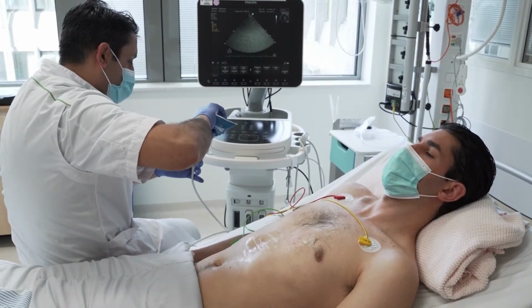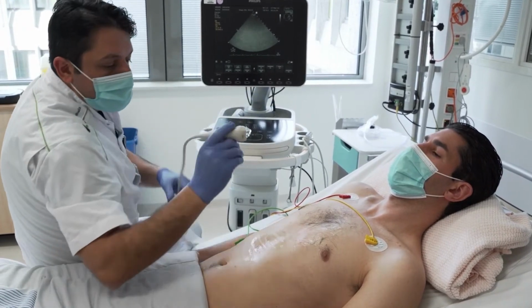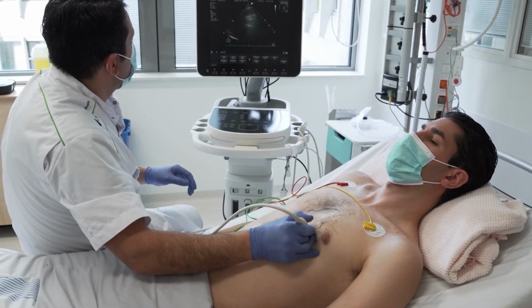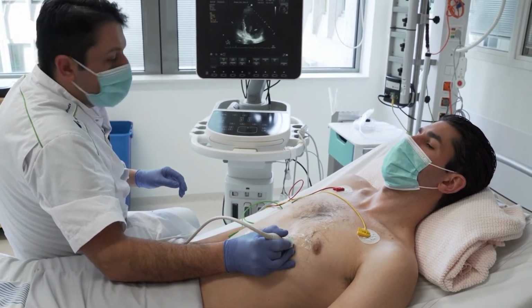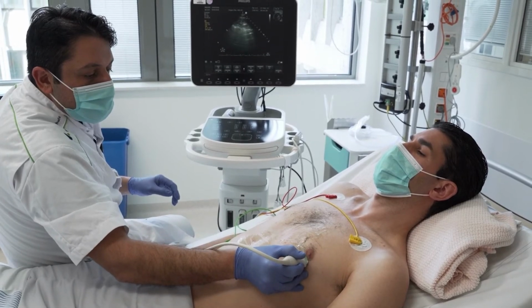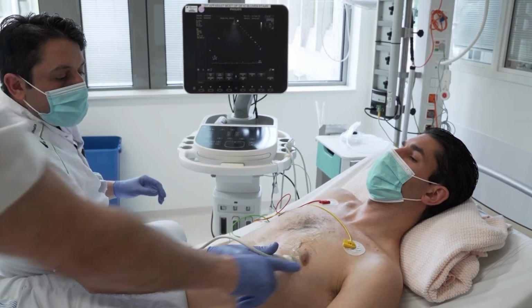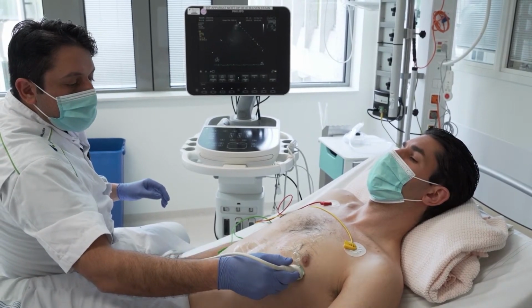We will now go to the third cardiac window. This is the apical window. And usually you start your search around the left nipple with the marker to the left axilla.